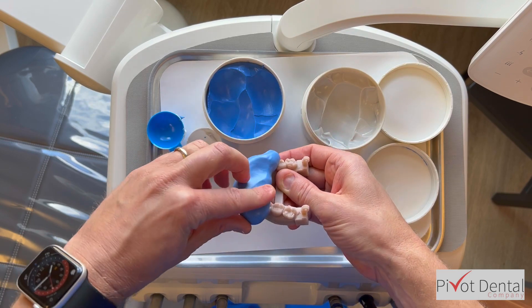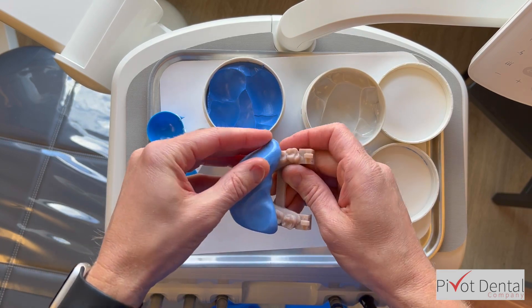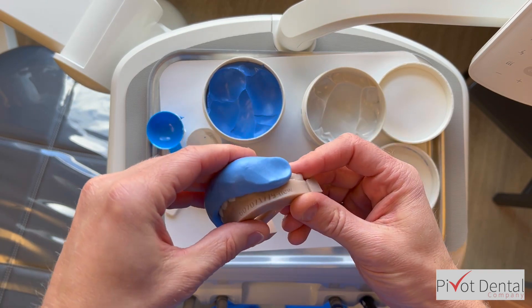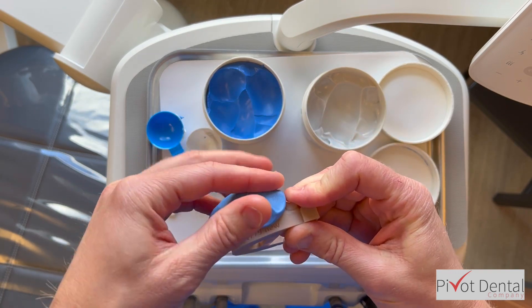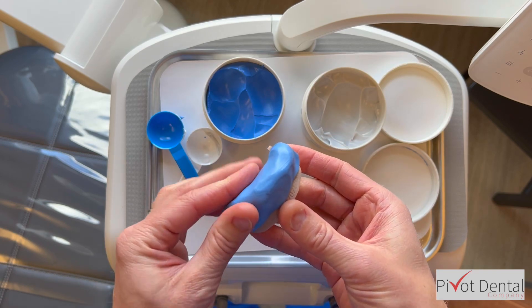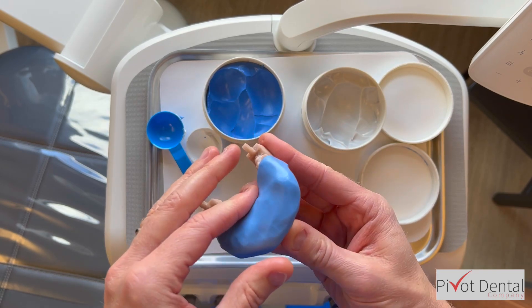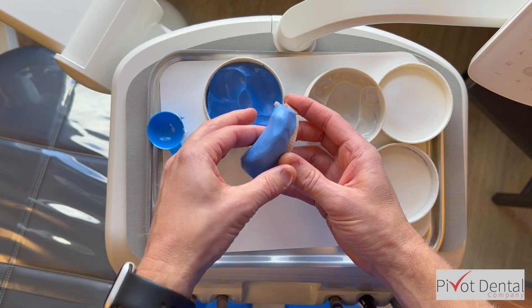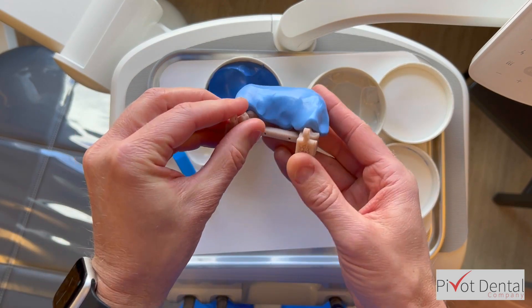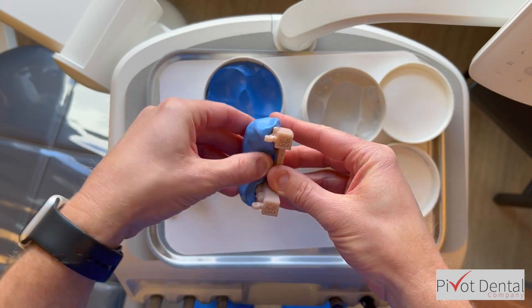I'm squishing the putty down on top of the model, making sure I spread it across the teeth that are going to be prepped, extending up to the gum line and beyond on the lingual surface. I want to make sure I get that gum tissue, and also across some of the other unprepped teeth. That gum surface on the buccal, lingual, and the unprepped teeth are going to serve as stops when I put the matrix into the mouth once the case is prepped.